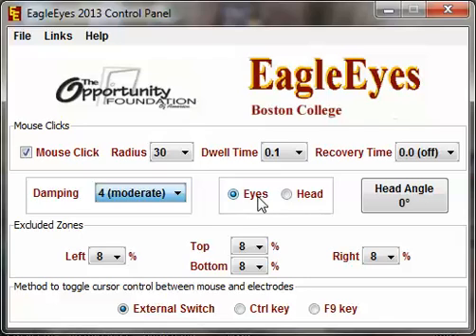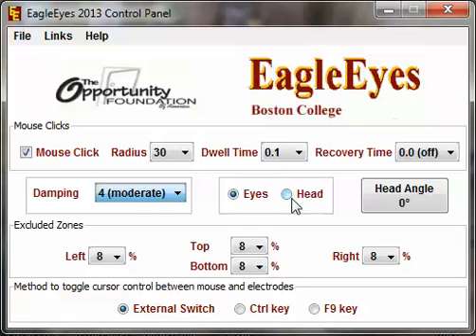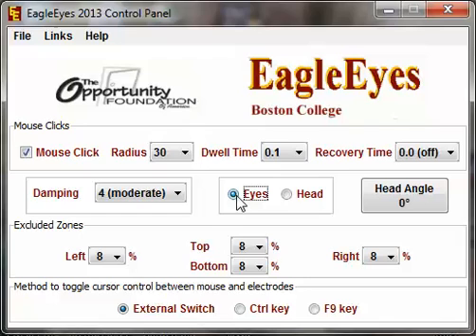The next setting is eyes versus head. All this does is reverse the signal. When using your eyes, you look left and right and the cursor follows. But if you use your head — staring at the screen and moving your head to the right — your eyes are actually looking left relative to the screen. Some users may want to use their head to move the cursor, so we can select that option to reverse the signal: right is now left, up is now down. For most users, we'll stay on the eyes setting.